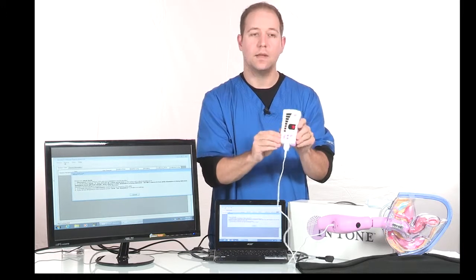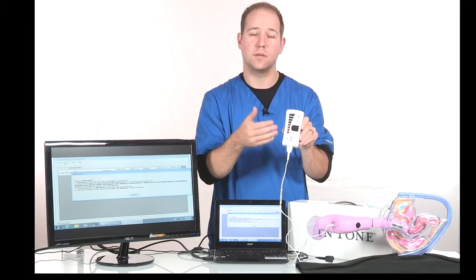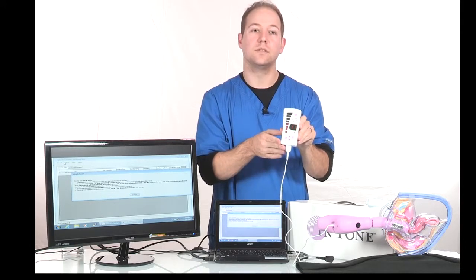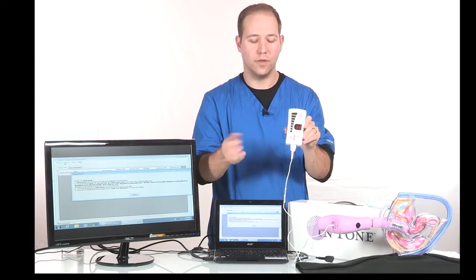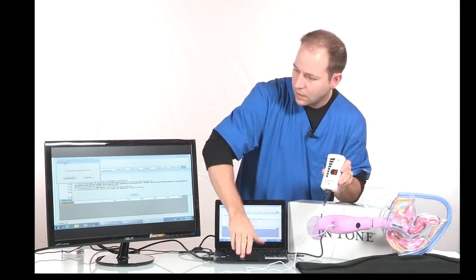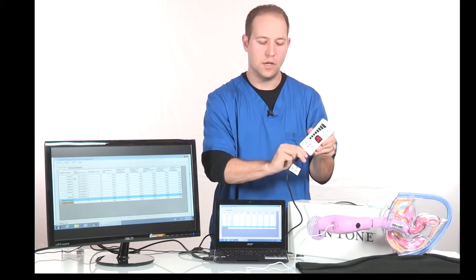Now, had the patient previously been at a 9 for their electrical stimulation, you will obviously increase it at least to a 10, sometimes to an 11 or a 12, depending on the patient's tolerability of the stimulation level. So in this case, we're going to increase it to an 11, so the patient feels the tingle and then they feel the tug. It's comfortable for them, so you unplug it, plug it back into your computer, and then click on Set Stim. We've now reprogrammed the patient's device after their 2 weeks to a higher stimulation level.